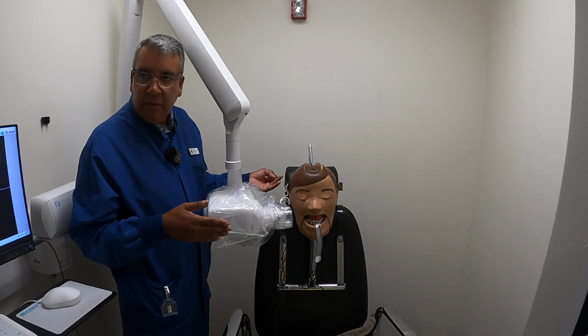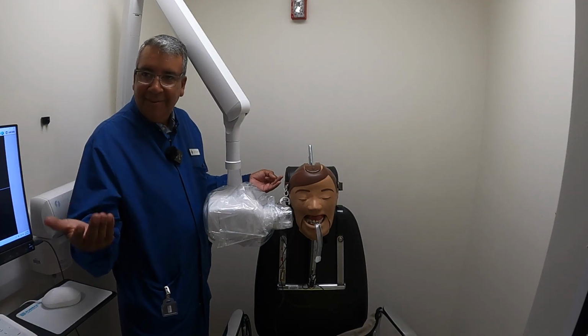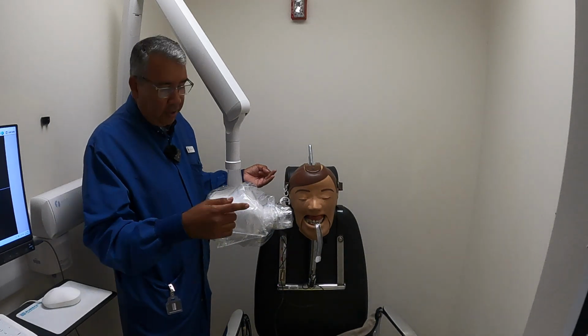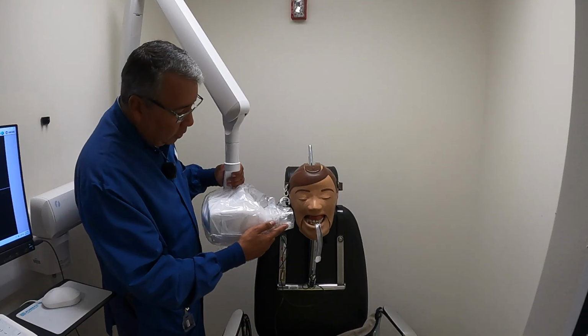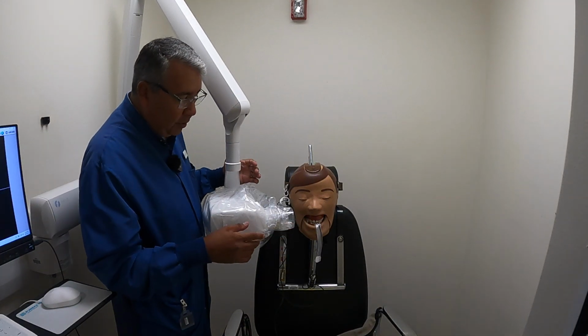In this case, we have to remind ourselves where the front of our sensor is. So if the front of our sensor is on what tooth? Premolar. Which premolar? Second premolar. It's on the second premolar. The side of this cone must then go to what tooth? The first premolar. So I'm going to take this, and now don't get confused and don't rotate.